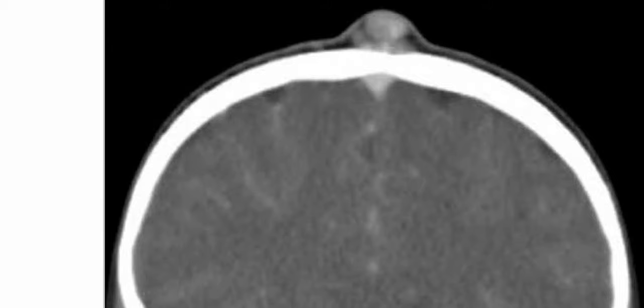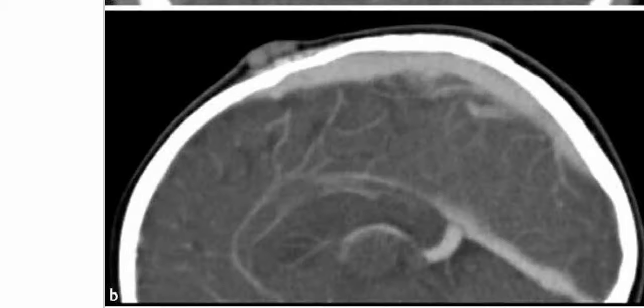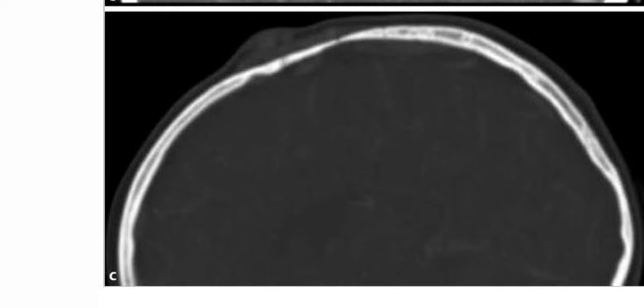This is a 6-year-old girl presenting with a soft bump on the head. The coronal reformatted post-contrast CT scan shows a circumscribed, avidly enhancing midline scalp mass with tubular components. The sagittal view of the same lesion in bone window shows that the calvarium is intact with absence of intracranial communication or extension. Considering this typical picture of an enhancing scalp lesion in a child, the diagnosis is hemangioma.